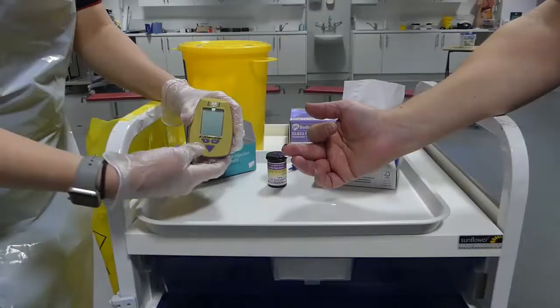Here we will use the Lactate Plus portable analyzer. Later in the video we will briefly look at our other portable devices. With the Lactate Plus we have the associated test strip and please notice that I have already taken one test strip out of the pot to avoid placing my finger in the pot and contaminating them.